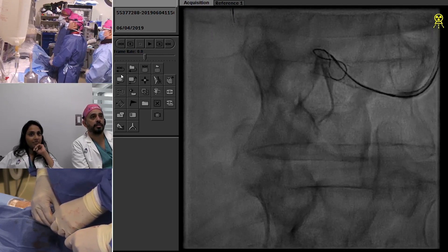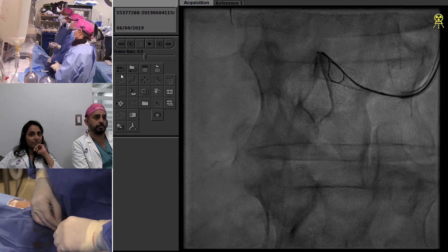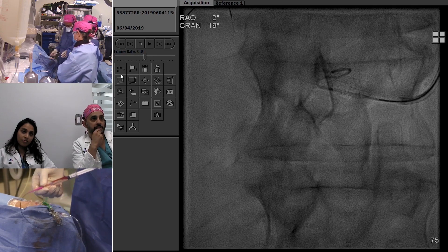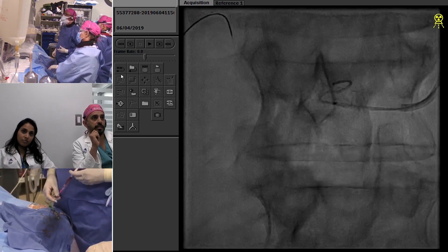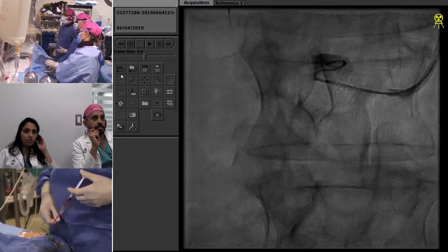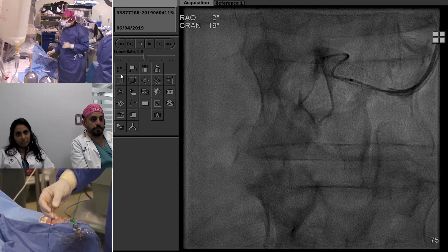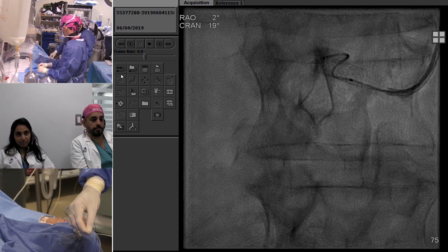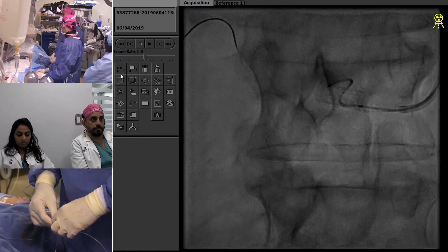We're now in one of the smaller cells of the stent interstices with the microcatheter. We crossed outside the stent and are going to have Adam back up the microwire to loop it around into the aneurysm sac. I'm getting blood return from the microcatheter, which is very important — if I had dug into the clot, injecting contrast would be a big mistake. A quick puff confirms we're in the aneurysm. Now with the protection of the stent, we start placing coils. Our default for radial cases is to track a 0.038 catheter over a 0.035 wire, which works over 90% of the time.